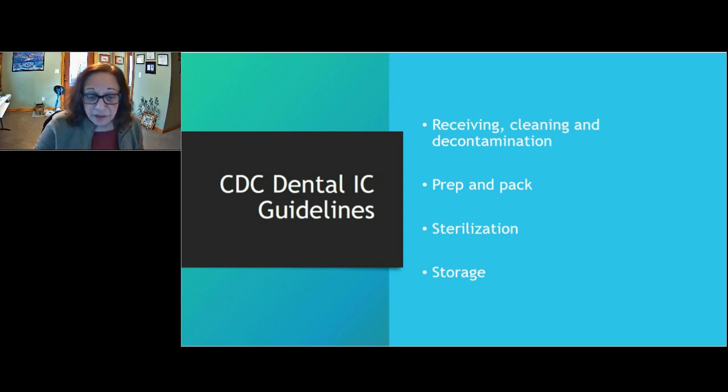I do want to comment on the CDC infection control guidelines. They are comprehensive, relatively speaking, because they cover everything in dental infection control from A to Z. However, when it comes to sterilization, they hit on the highlights, truly just the highlights, as does the American Dental Association. You know, they talk about, as Joanne had alluded to, putting chemical indicators inside the peel pouches. And the CDC dental infection control guidelines I'm citing here do talk about the separate areas, but they don't give you enough detail of how to get there.